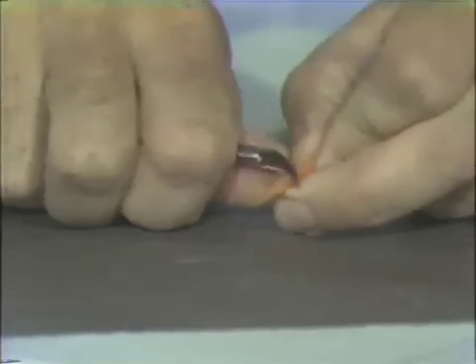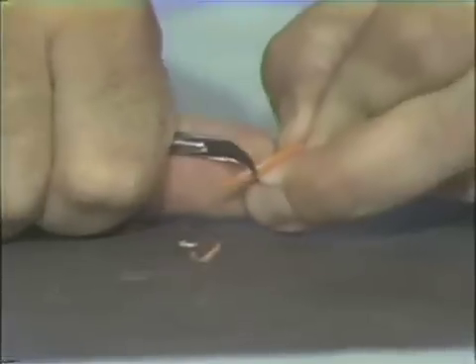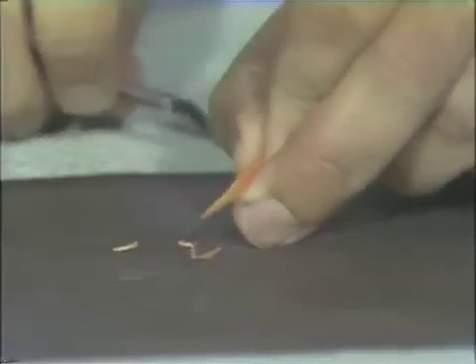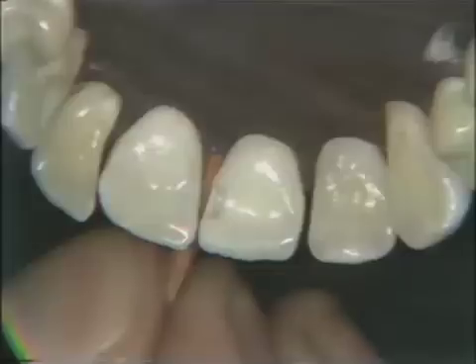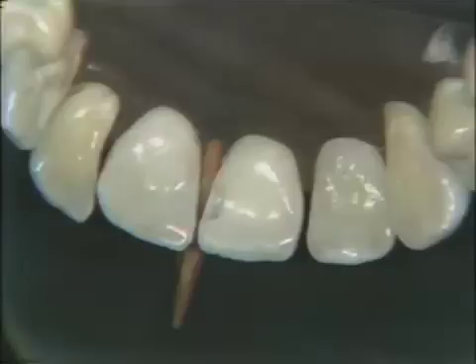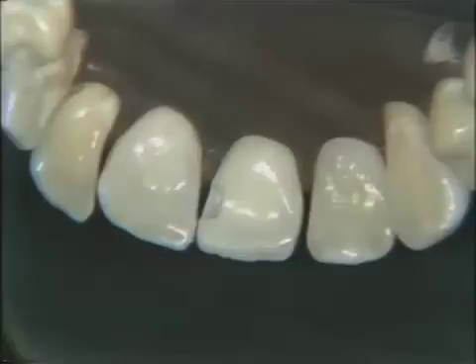And we noticed that as we placed it into the preparation or beneath it at the cervical, it was a little too high. This would then result in a concavity of our preparation at the cervical, which, of course, would give us a gingival problem and also a good place for plaque and food particles to catch, and thus recurrent decay. Now that cervical wedge is very nice at the cervical.